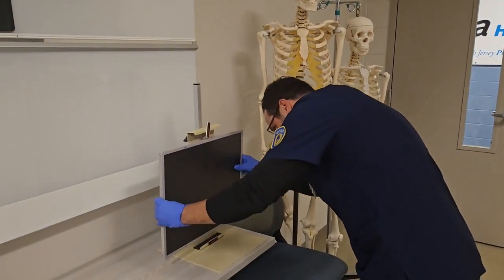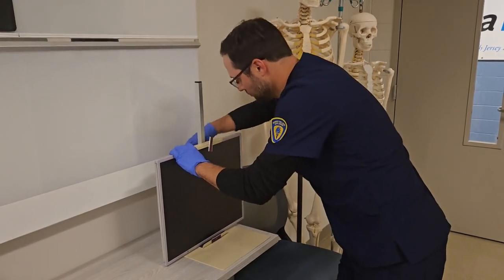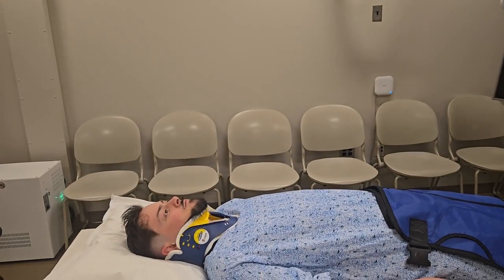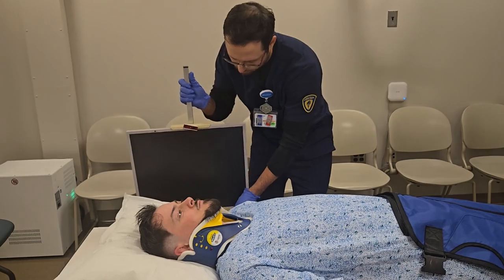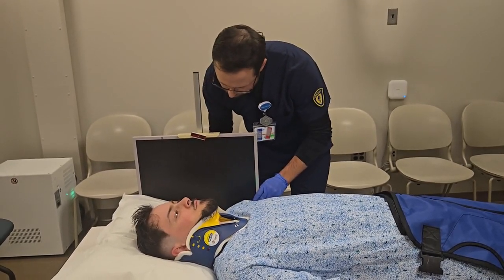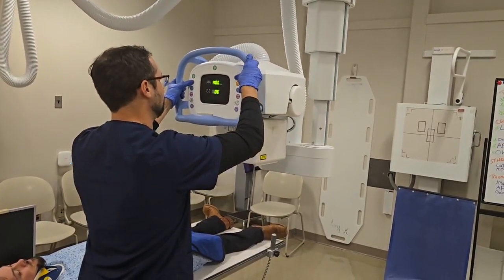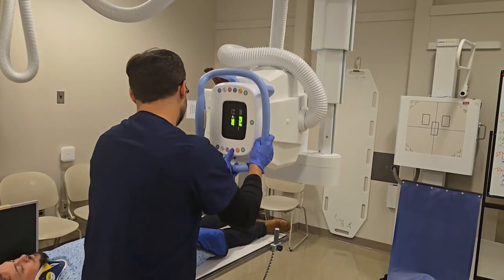This is the left lateral cervical spine cross-table projection used in trauma with spinal precautions. Place the image receptor vertically at the patient's shoulder. Gently pull the shoulders downward if possible to visualize lower cervical vertebrae without compromising patient safety. Direct the central ray horizontally to C4 at the level of the thyroid cartilage.